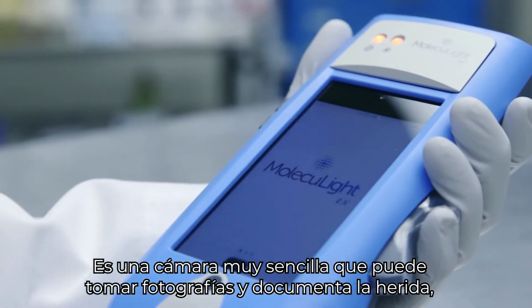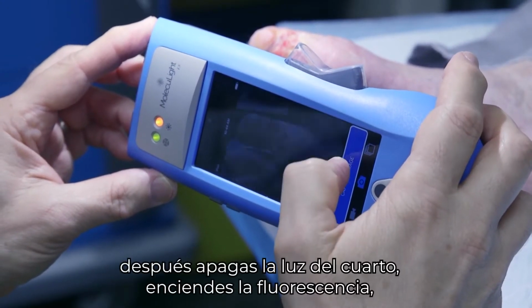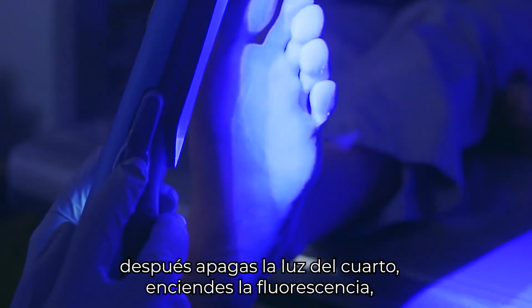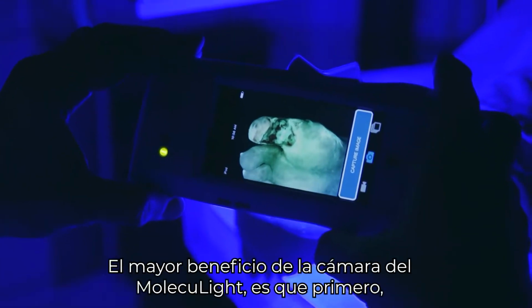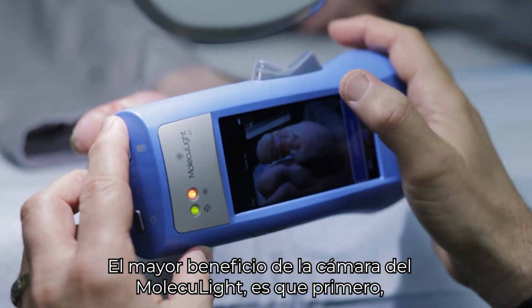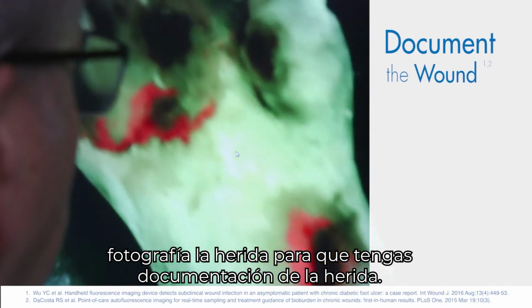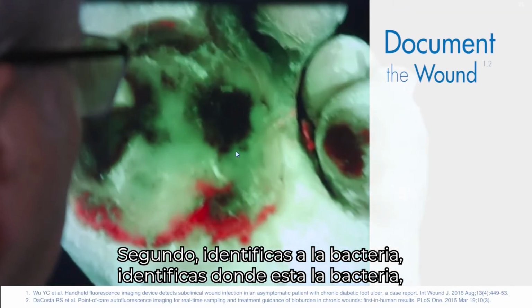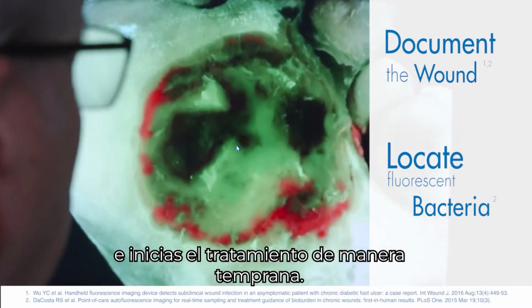It's a very simple camera that you can take a picture and document the wound, and then you turn off the lights in the room, turn on the fluorescence, and you can see right away whether there's fluorescence coming off that wound. The major benefits of the MolecuLight camera is that first it photographs the wound, so you have documentation of the wound. Secondly, you identify the bacteria, you identify where the bacteria is, and you start treatment early.